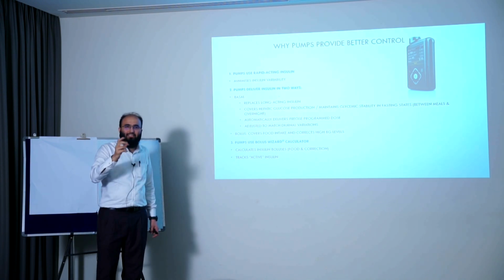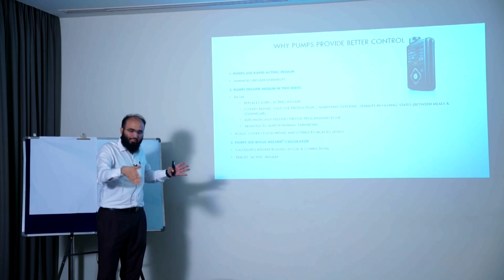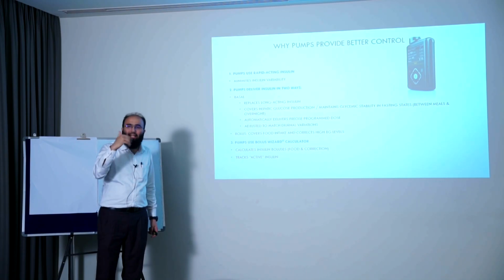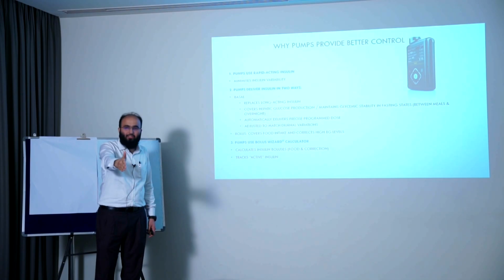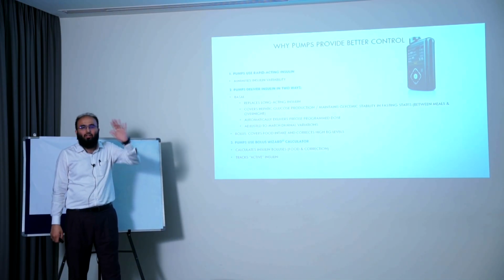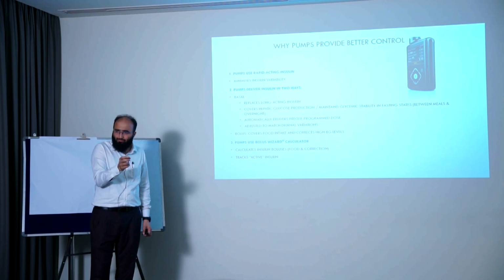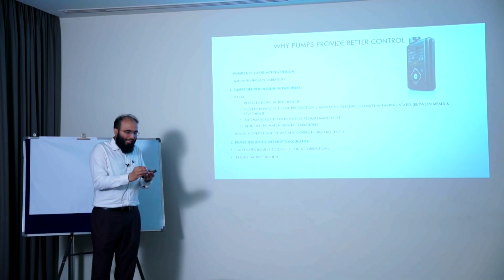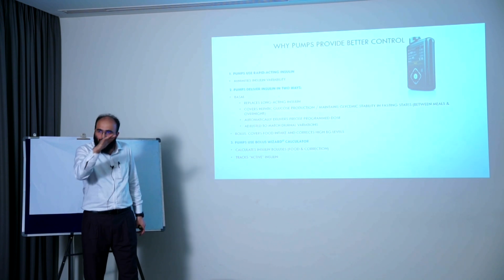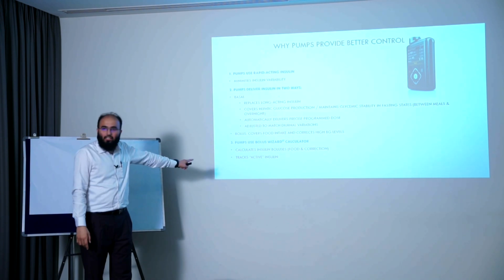If you have seen inpatient management of blood glucose, we keep one basal insulin and then three rapid acting insulins. Say 6 units is what we had planned: 6 in breakfast, 6 in lunch, 6 in dinner. And now your pre-lunch sugar, instead of 120, is 250. So here you apply the correction factor, and to that 6 units you add 2 units additionally so that post-lunch sugar again comes to maybe 160, 170. You are doing that manually for your patients. This wizard does it for you.